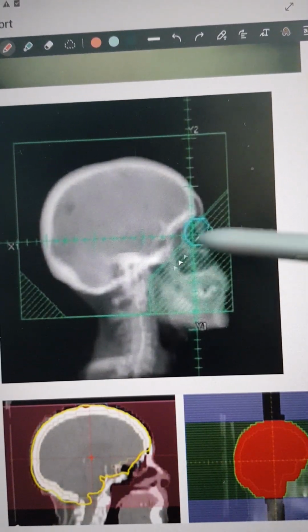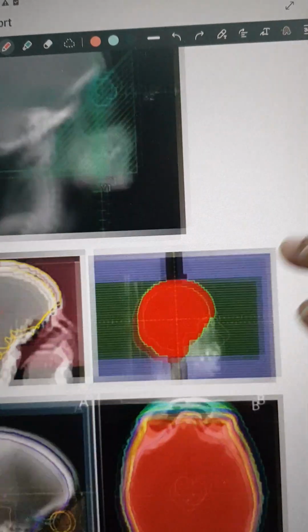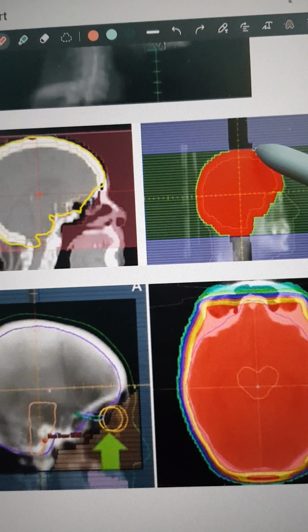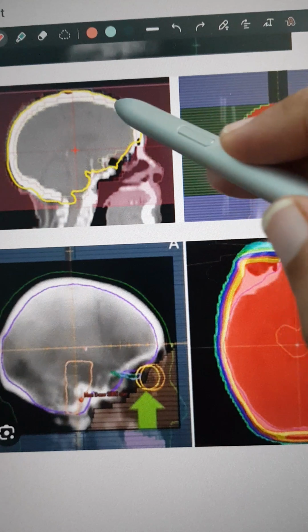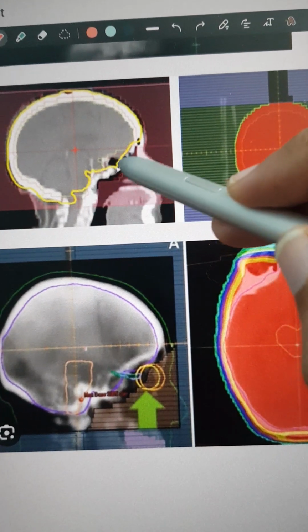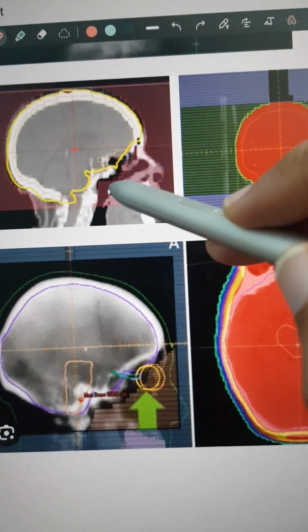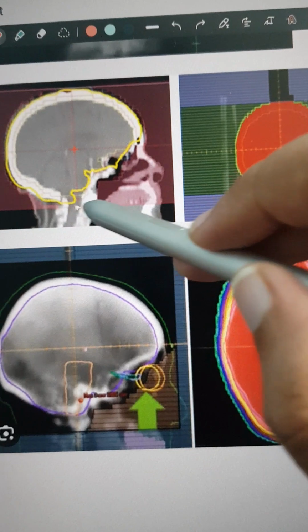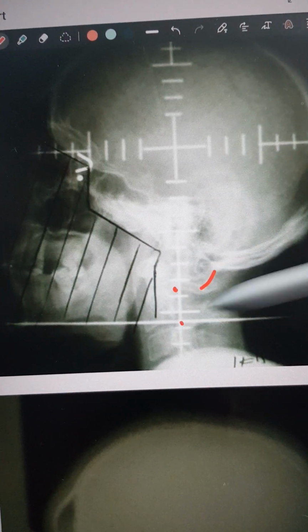The same thing is being used in current technology. And yeah, nowadays we use MLCs which almost approximate the whole area. Here, it is like fall off, fall off, fall off, but yeah, you can see the MLC is covering completely over here. So you include the hypophysis, the posterior part of the lens, 2 centimeters behind the lens, and C2 vertebrae is the lower level. So you can see here the C2 vertebrae level, or in this image C2 vertebrae. This is C1, this is C2.